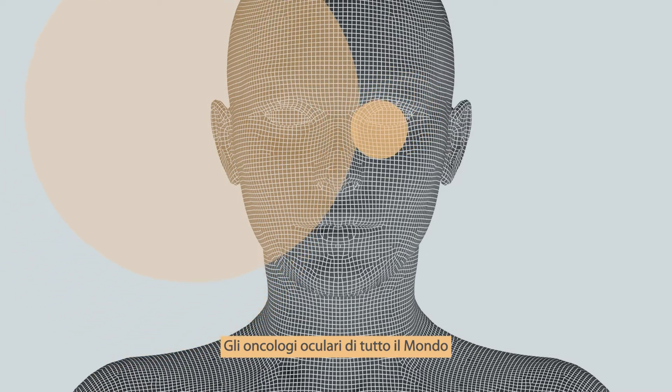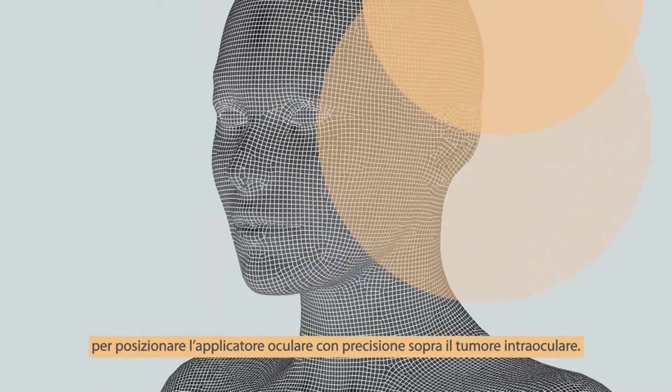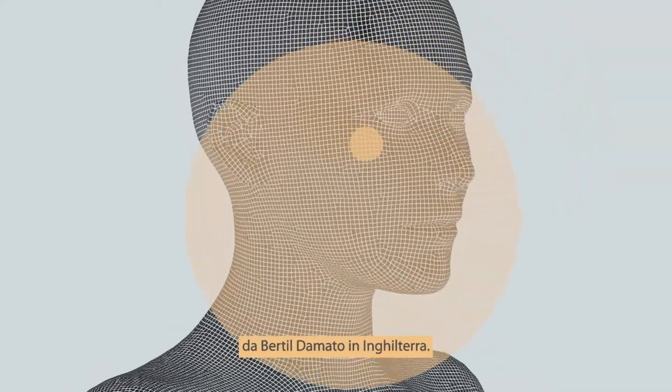A variety of surgical techniques have been developed by ocular oncologists around the world to place the applicator accurately over the intraocular tumor. This short presentation describes methods developed by Bertil D'Amato in England.